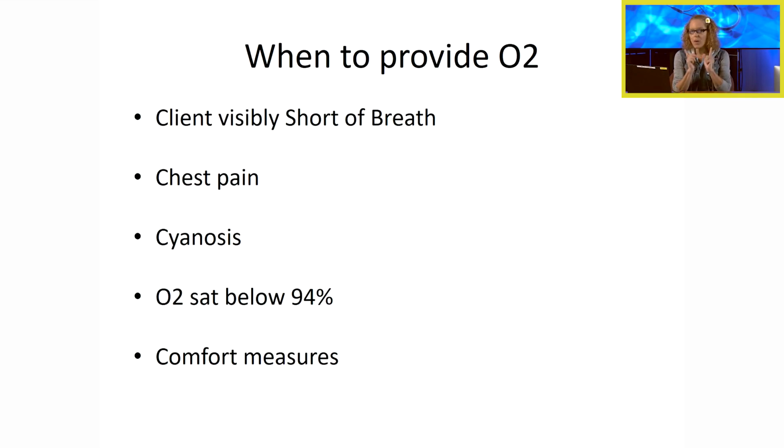So, when do we need to provide oxygen to our patients? Believe it or not, oxygen is considered a drug, right? We don't just give anybody oxygen just because. We have to be thoughtful in assessing our patients for their need for oxygen therapy.